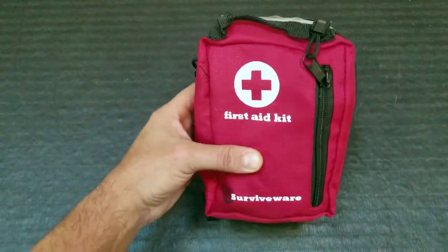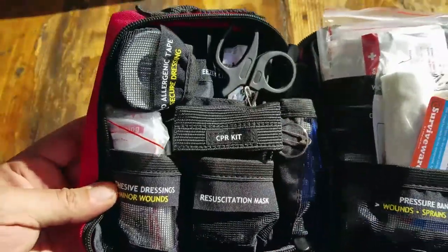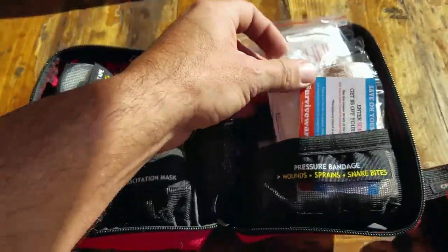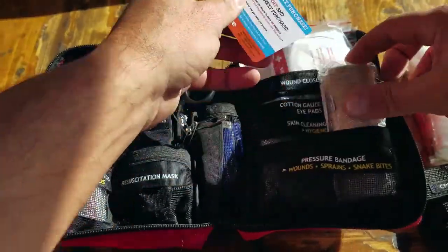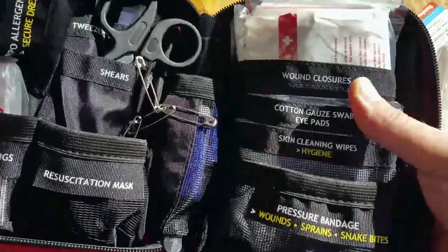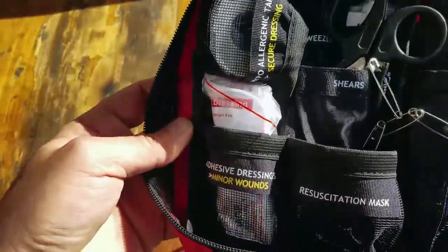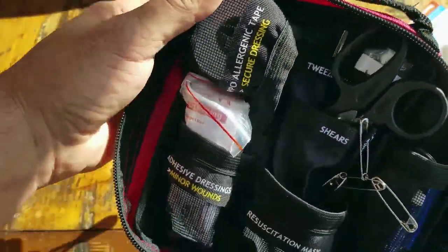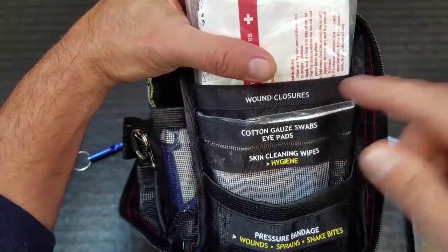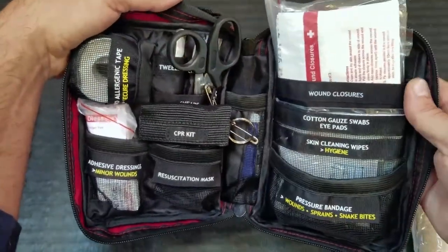Another impressive feature with this first aid kit is basically the way that it's set up. If we go ahead and open this up, you can tell that everything is organized and labeled, which is an excellent feature. As you can imagine, during a crisis or an emergency where you're going to need a first aid kit, there might be a lot of panicking going on — limbic system kicking in, especially when it's a family member or loved one. So even when you are well-versed and well-trained, being able to have everything labeled instead of fumbling around and wasting time is a super key component to this kit.